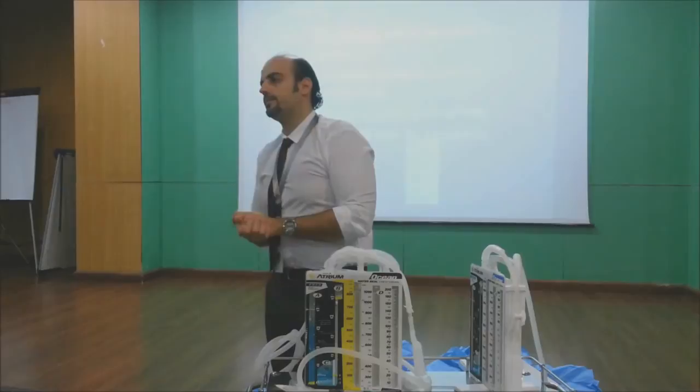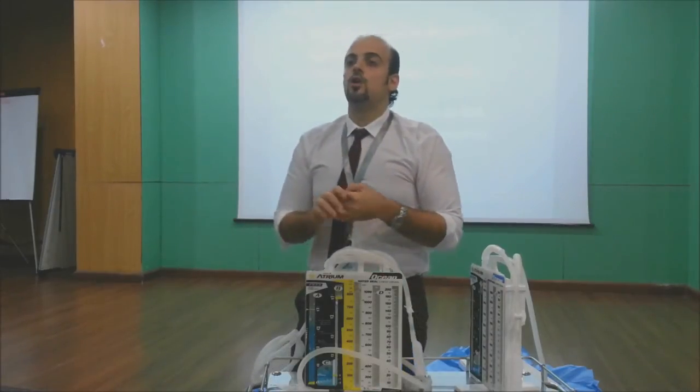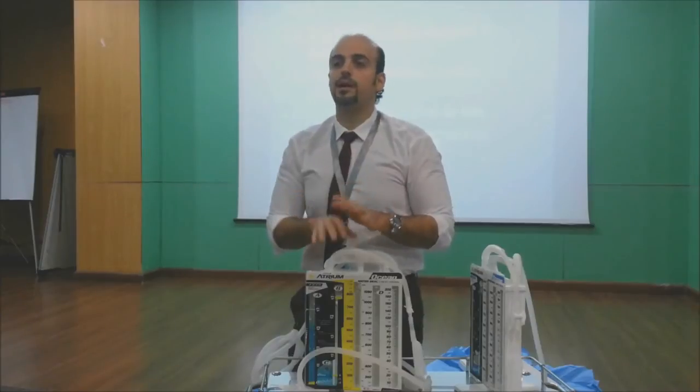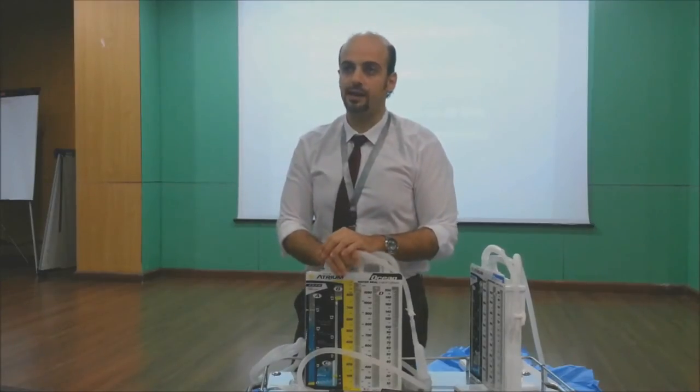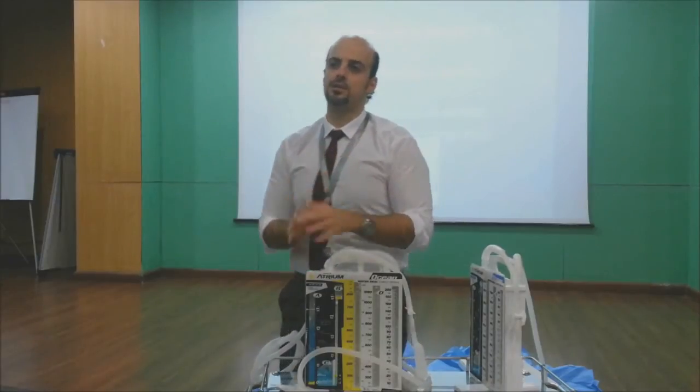Any question, guys? Summarize it. We should change the tube or we just... No, we just keep it for drainage. Keep it as a drain. I don't care now about the negative suction.